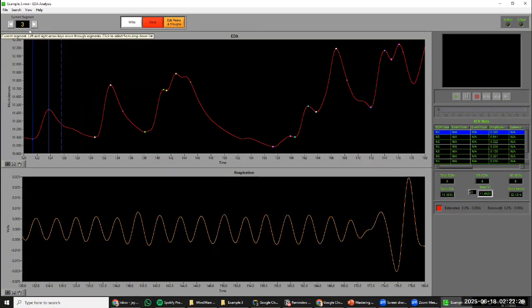Usually if I'm looking at a 60-second segment and I'm seeing something above like 15 to 20 SCRs, this is when I might want to look at this a little bit closer, such as, do I have the correct sampling rate? But there's really not a complete limit. It's just that something above 15 would be a normal outlier.